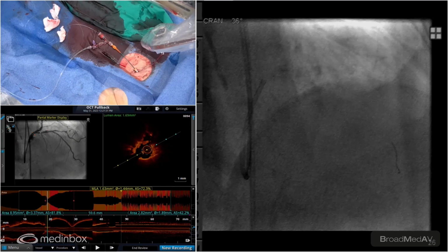Oops, sorry. Arjun, you've done this before, I'm assuming? Yeah. Okay. I'll let you put this on. Are we going with the better eyesight? Yeah, he's younger. He's got better eyes. I can't see. I don't have my focals on. You steer for the old system. Get out of your way here.